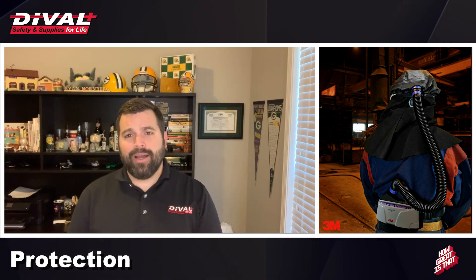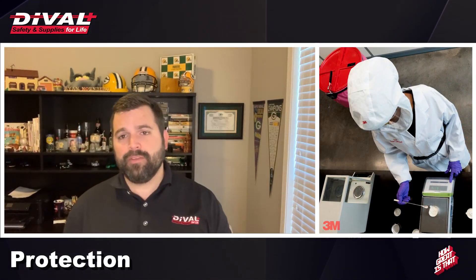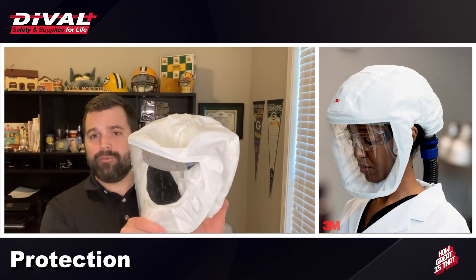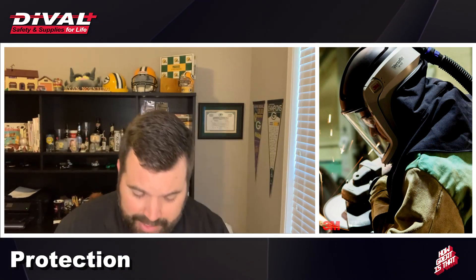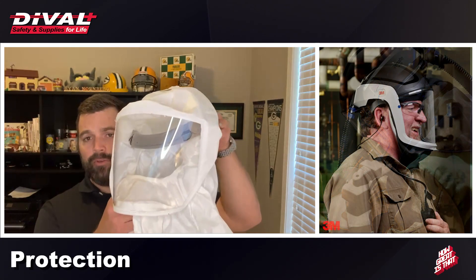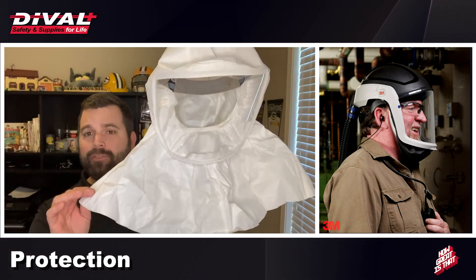PAPR devices also provide an increased level of protection compared to traditional N95 half-face and full-face respirators. Even with the most standard face piece, you get full face coverage as well as top-of-head protection from environmental factors. If increased coverage is needed, there are hoods which cover the entire head down to the neck, and options that go all the way down to the shoulder.